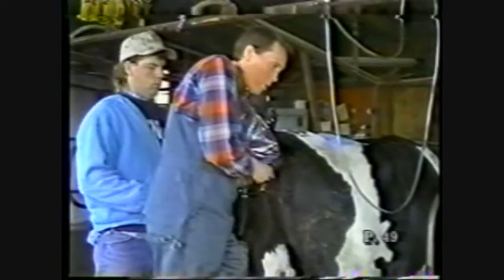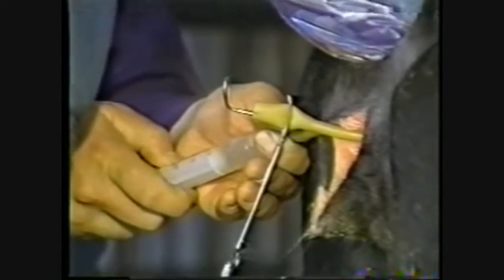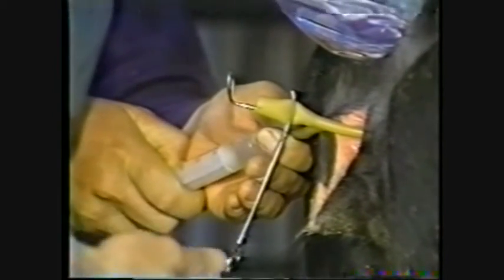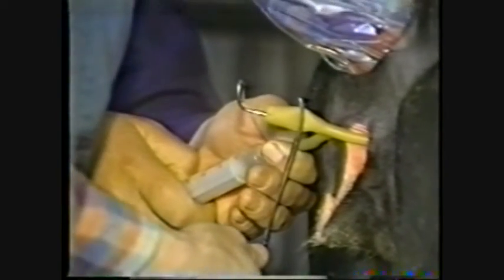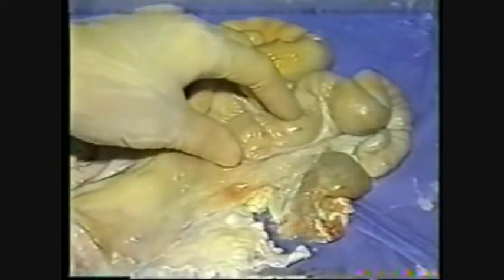Okay, we're in position. Place 10 cc's of air up in the catheter. I can start to feel the balloon. Give me one more. One more. One more cc. About 13 of air in the balloon. One more, please. Let's stop right there. We're in good position. At this point, we're going to plug on.